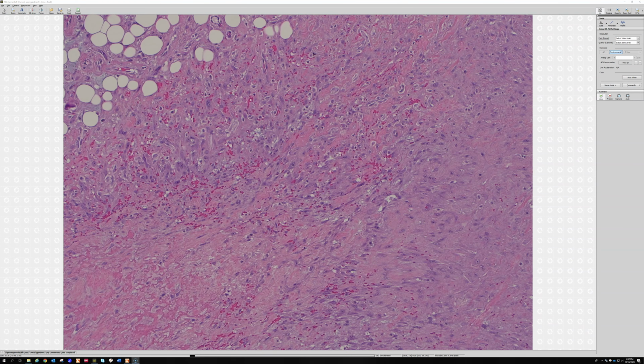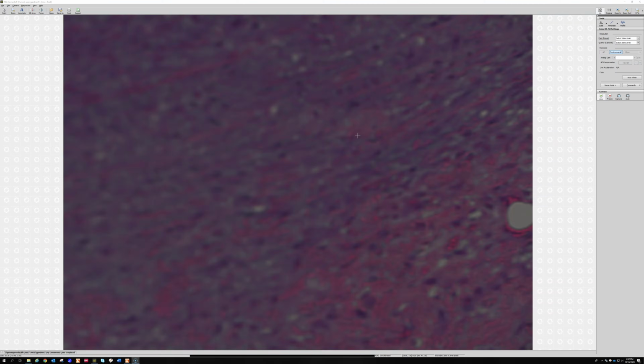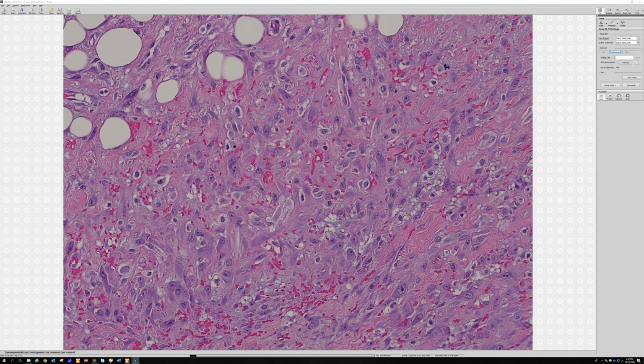And also, if you did CD34, usually much of the lesion, except for the vessels, will be CD34 negative most of the time. And these areas here actually look really scary. But there are some ganglion-like cells intermingled with really juicy, revved up endothelial cells. See, they're starting to make new vessels, just like the vessels in really robust granulation tissue. So that can look really scary.